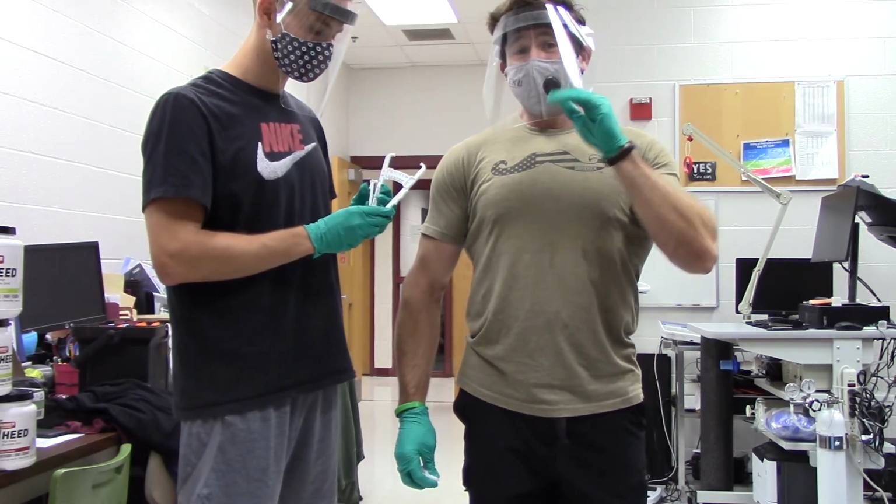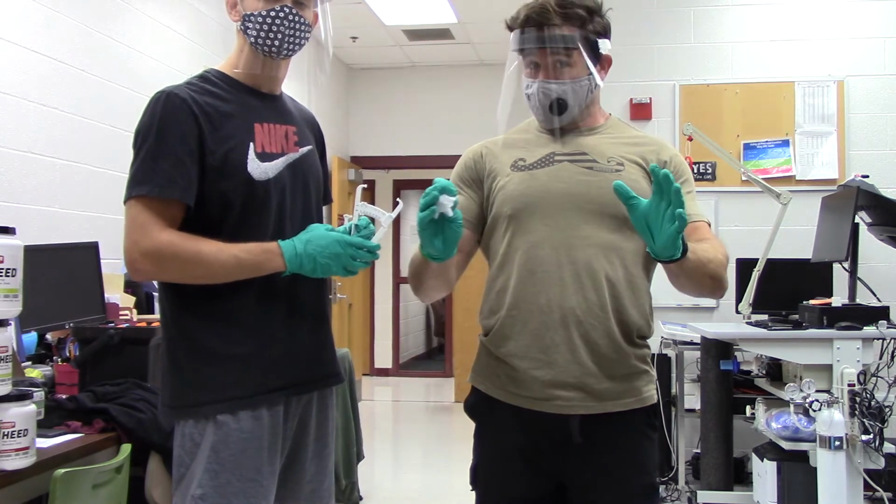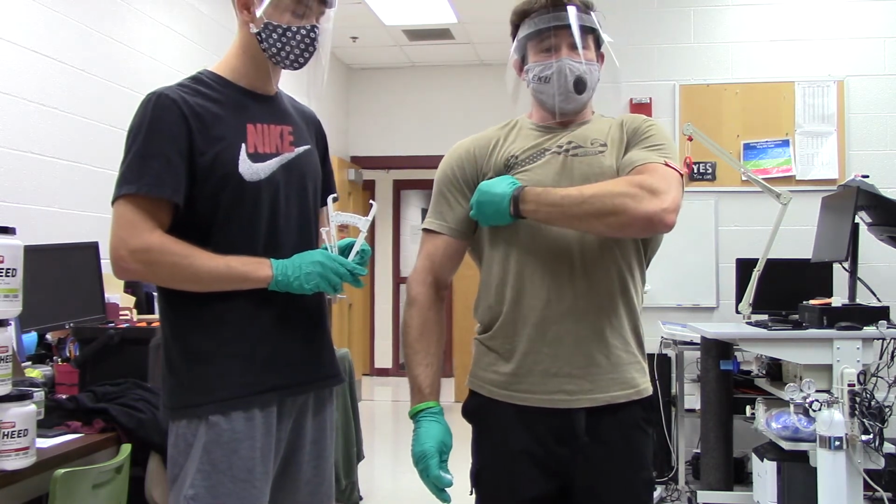nipple, and we do not need to actually see where the nipple is at. We're going to guess, okay? But it's just going to be 1/3 the distance, so it's going to be much tighter into the armpit.